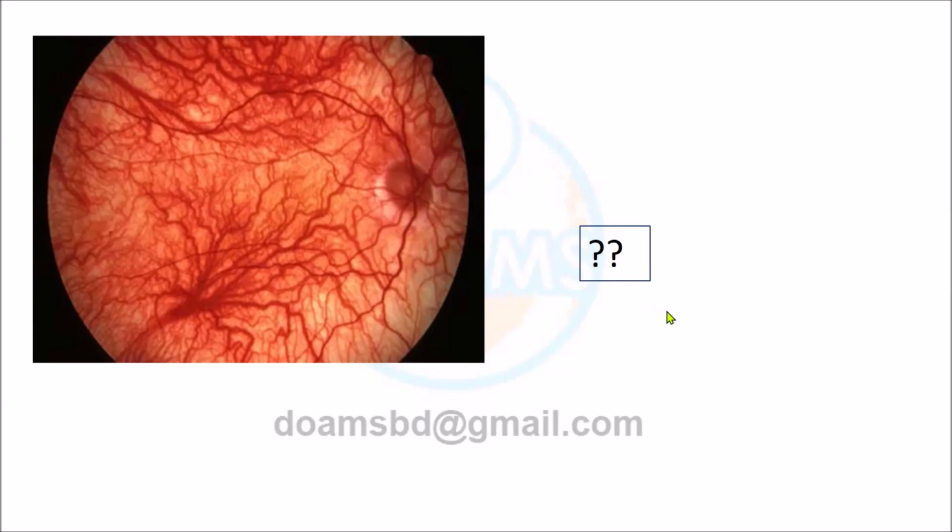But on the first day of Ramadan, are you having any trouble with me or not? Let's see. And you look at the retina. A lot of vessels you can see, right? Yes, sir. Vascularity.